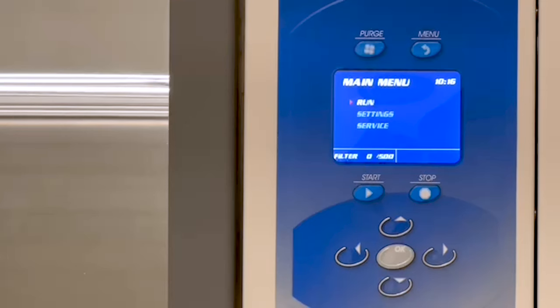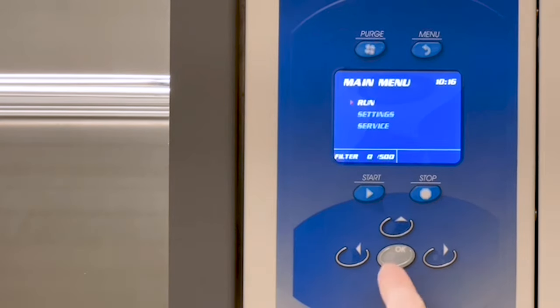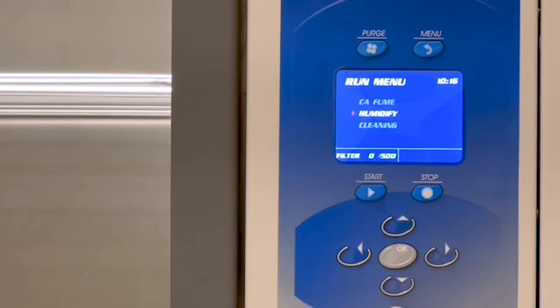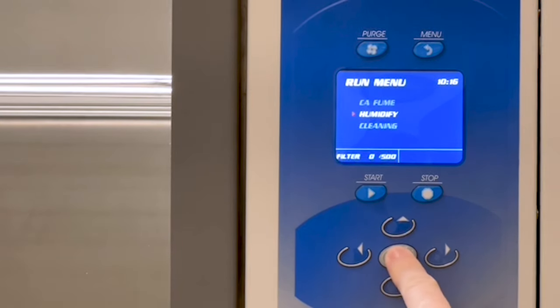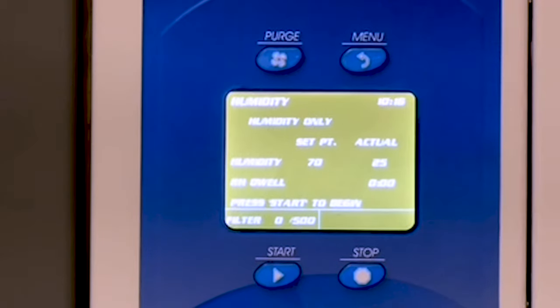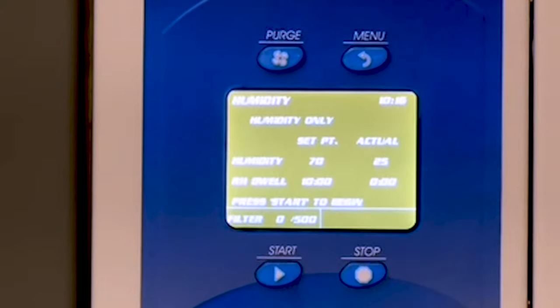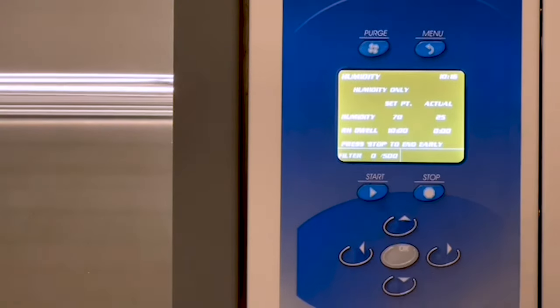Power on the unit, and from the main menu, select Run and press OK. From the Run menu, select Humidify and press OK. Enter 70% for the relative humidity setpoint and 10 minutes for the RH dwell, and press Start. The dwell refers to the time during the calibration process that the internal fan will circulate the air for uniform humidity levels inside the chamber.